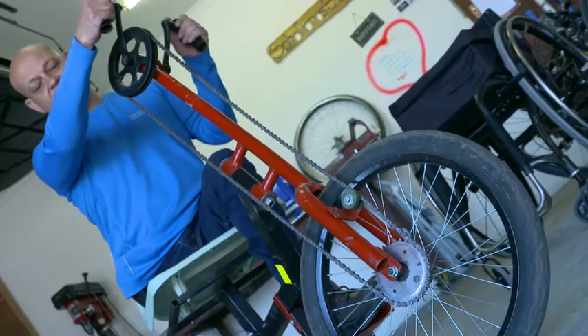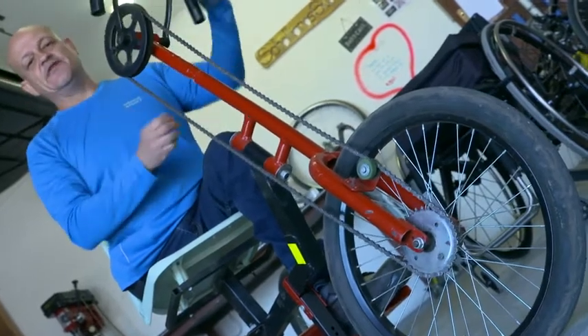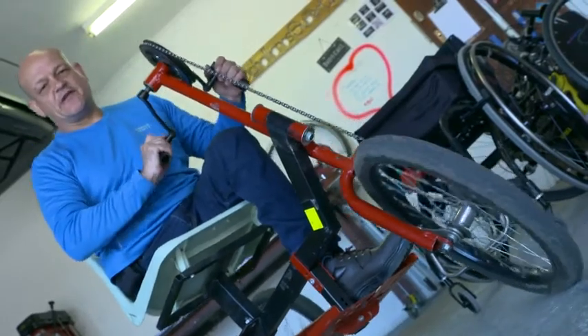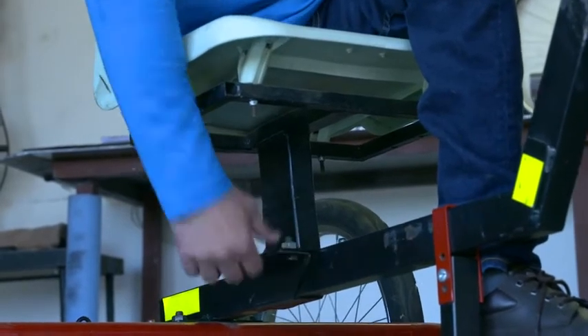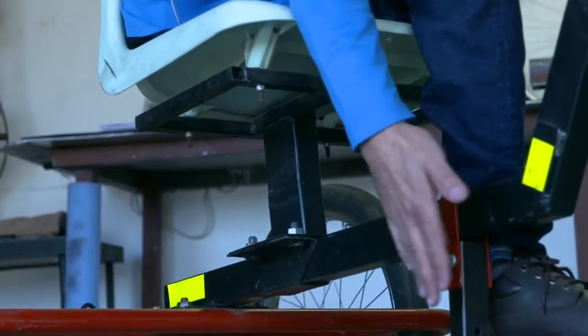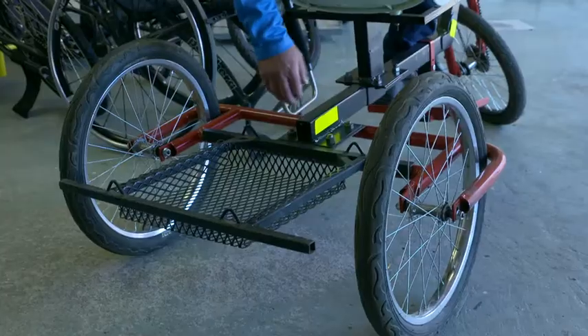When you push forward on the handles, it creates a forward movement with a back pedal brake system. And if you need to reverse, you can just pull the handles back and press down and you can go backwards. The seat is fully adjustable and by just loosening the four bolts on the bottom here, you can adjust the seat forward and backwards to get in line with your footrest, which is also adjustable up and down or forward or backwards.